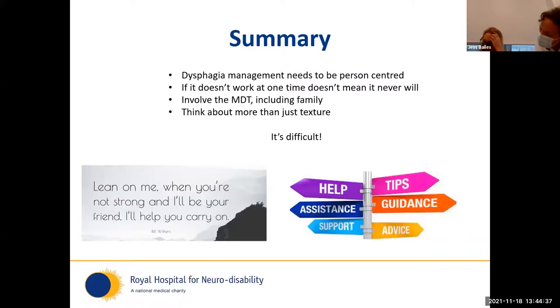There's a question about FEES in PDOC. What are the outcomes and indications, including tracheostomy? So we do FEES in PDOC quite regularly. I'd say it's largely used in terms of tracheostomy and weaning from tracheostomy, and looking at saliva management. So probably about half our referrals coming into the FEES clinic are for saliva management, and generally for people with a tracheostomy.